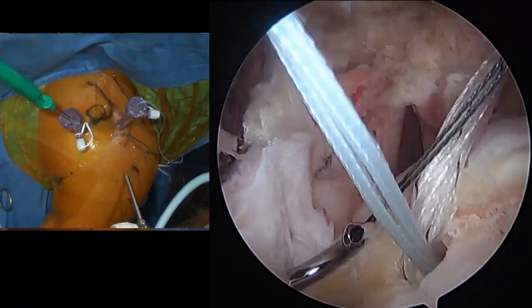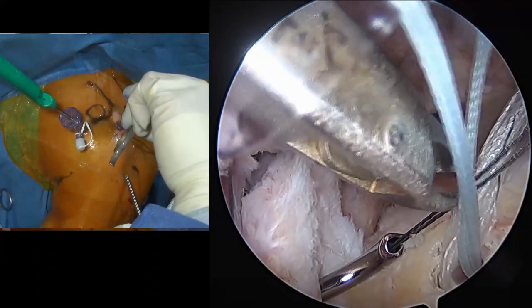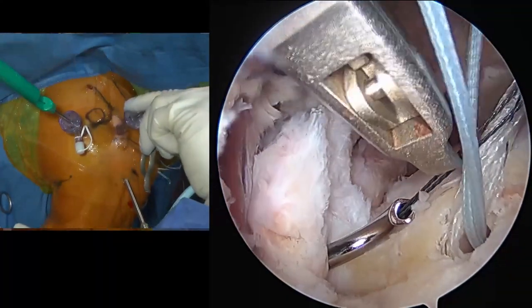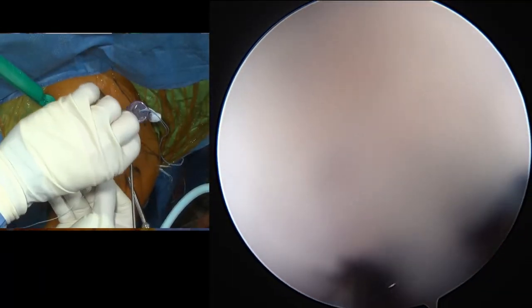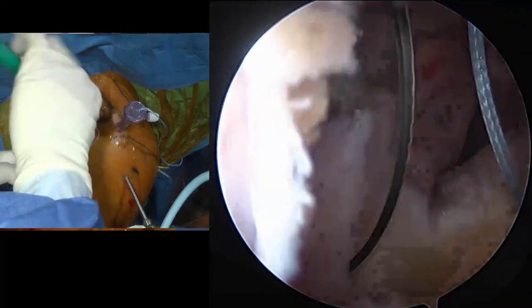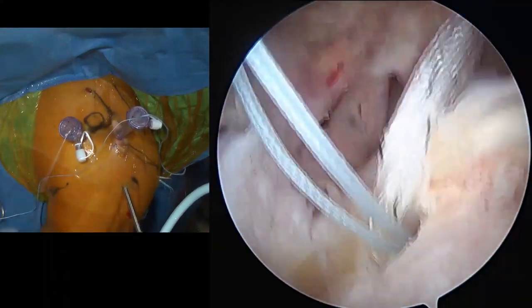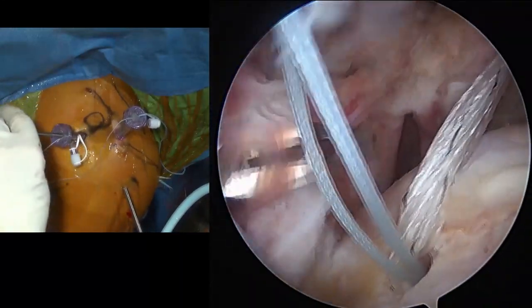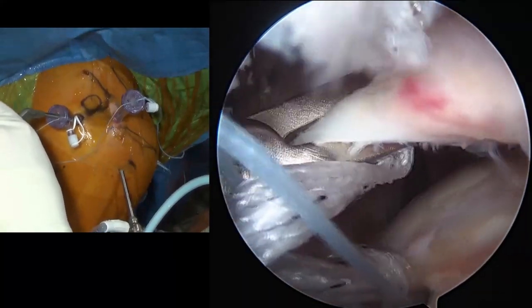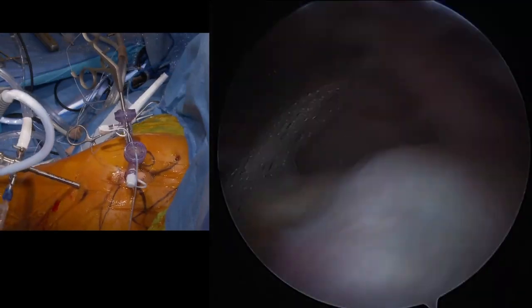Suture retriever. Okay, number two fiber wire. Pass the fiber wire through this wire loop. Hang on. Okay, pass it through. Okay. Okay, let go, let go. Okay, take that. Okay, and then kingfisher. And then I'll need the lasso back again. Hold the scope for me, right there. Hold it there.